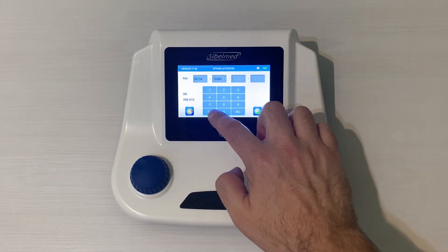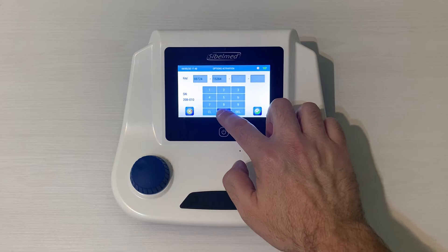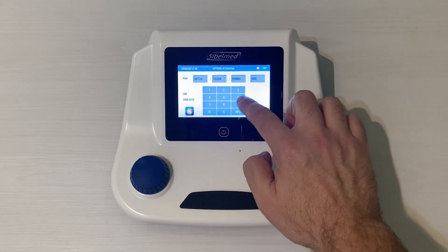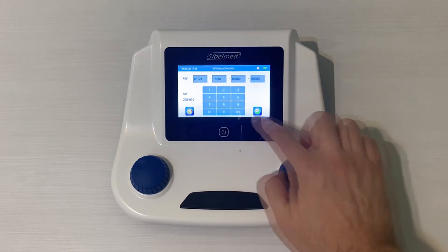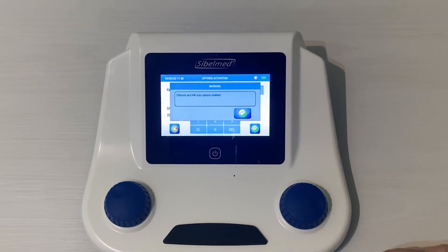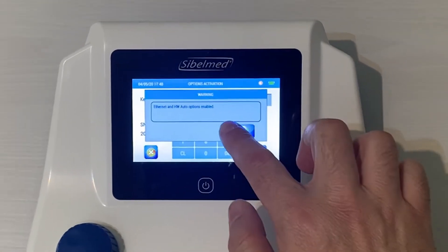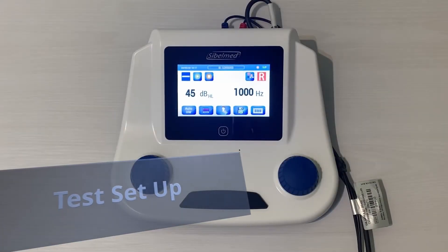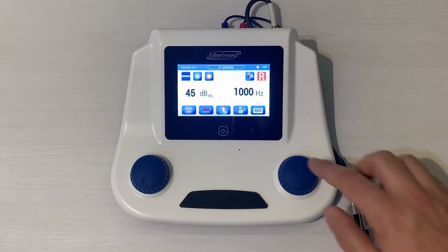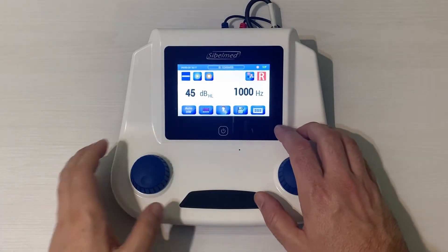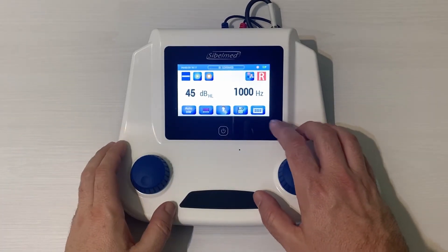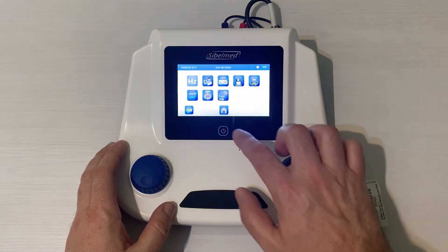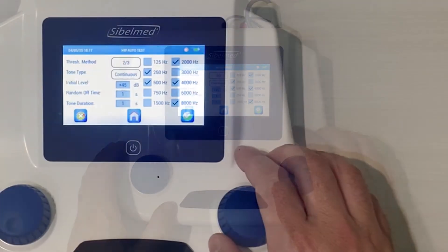The Hewson Westlake test allows users to perform an air conduction tonal test in a fast, simple manner with minimum technician intervention. To perform an automatic test, you must select the mode on the main screen. To personalize various parameters for the automatic test, access the Test Configuration menu and press the Test HW icon.